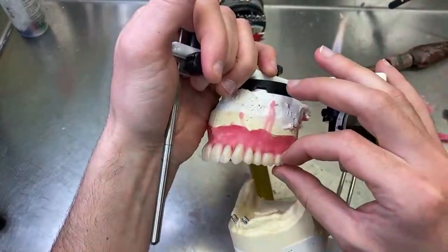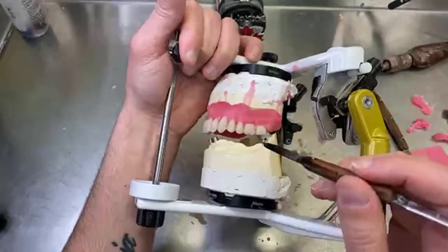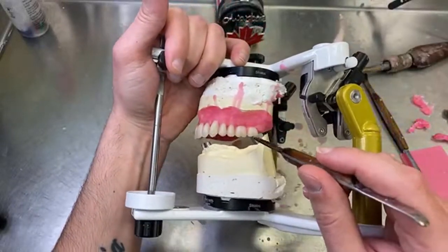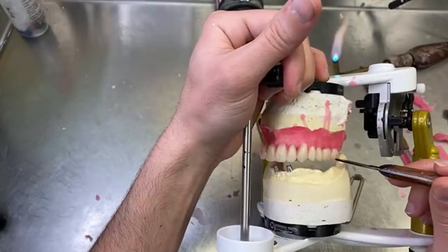Perfect balance, it's a trying case, so what do you expect? Balancing comes at the end. And you notice a little thing here. I do a little curve because of where the retromolar pad is coming up. I don't want it to be straight, and then the tooth will have to start from here.